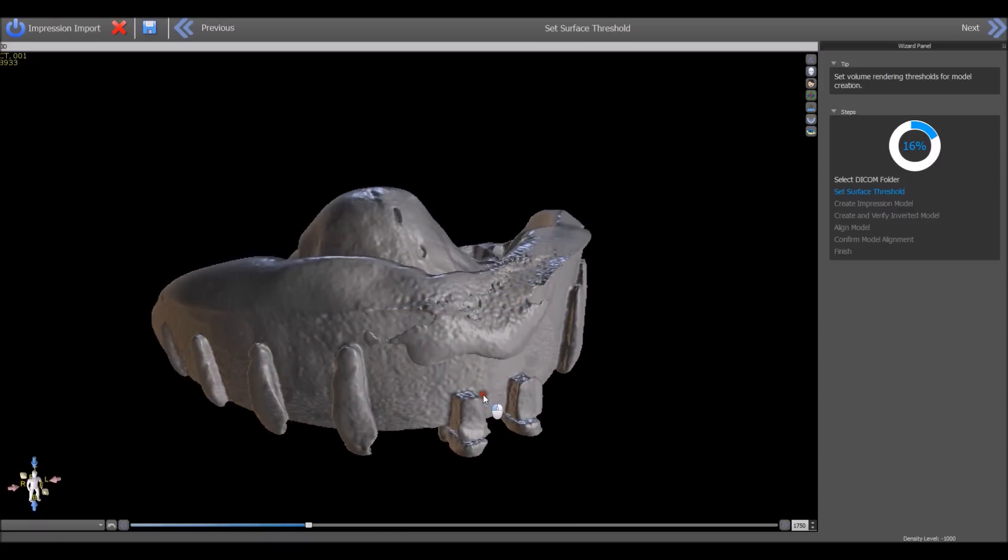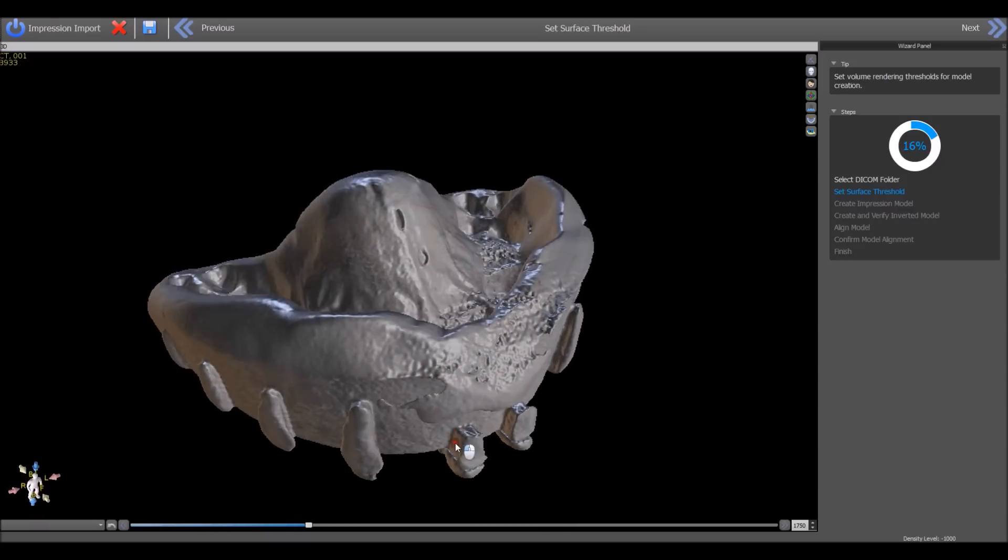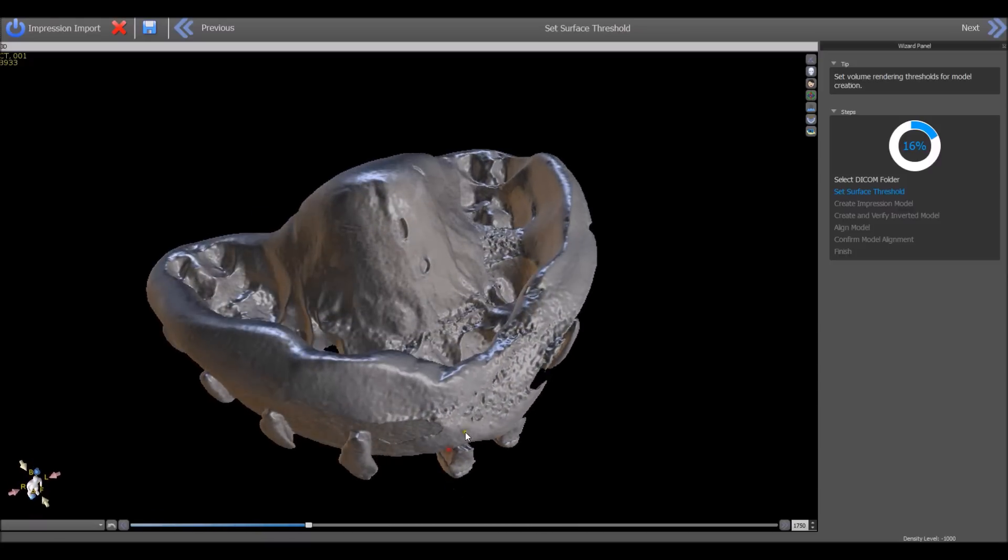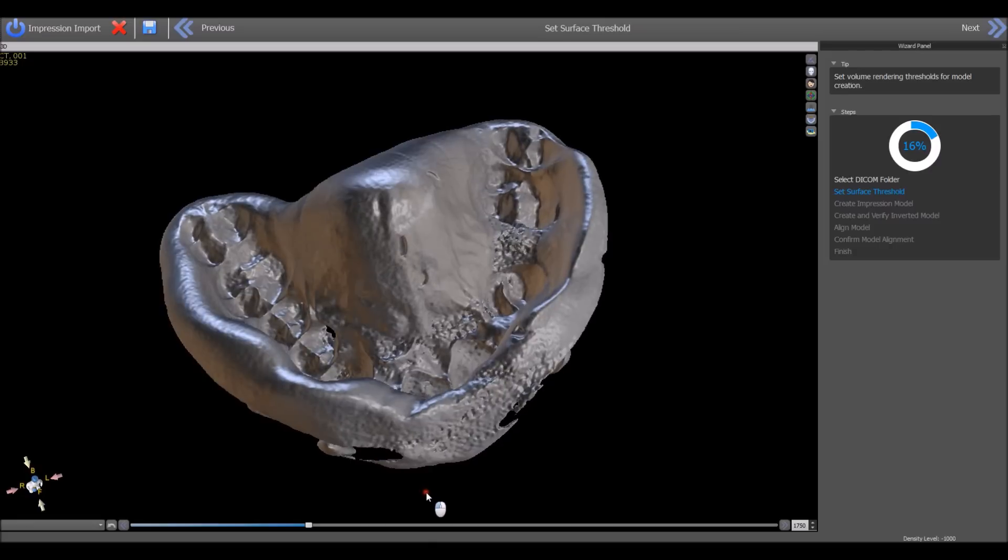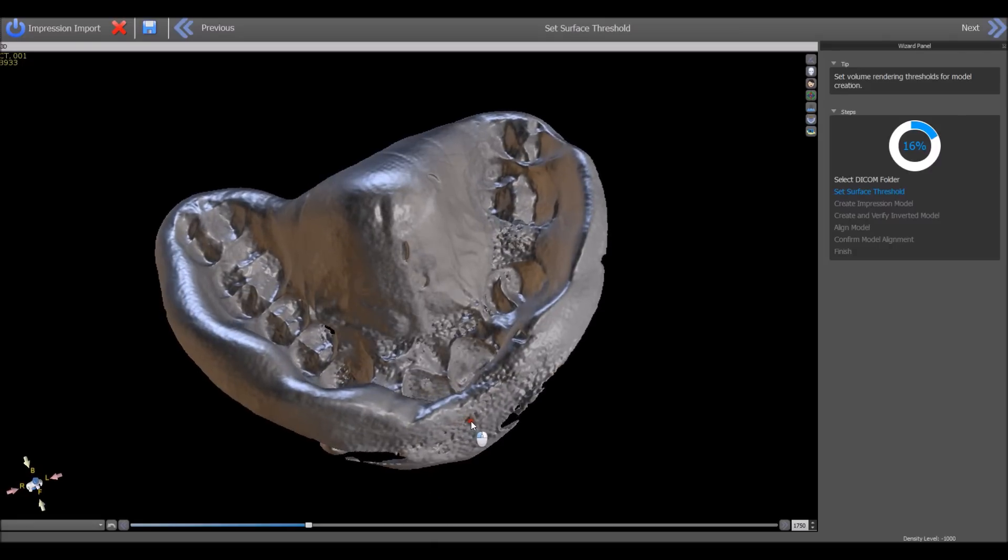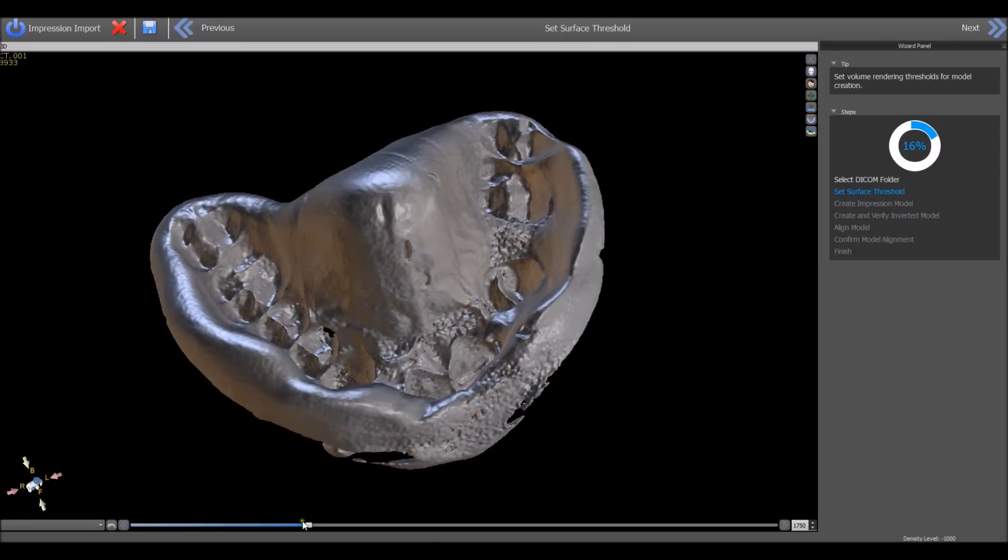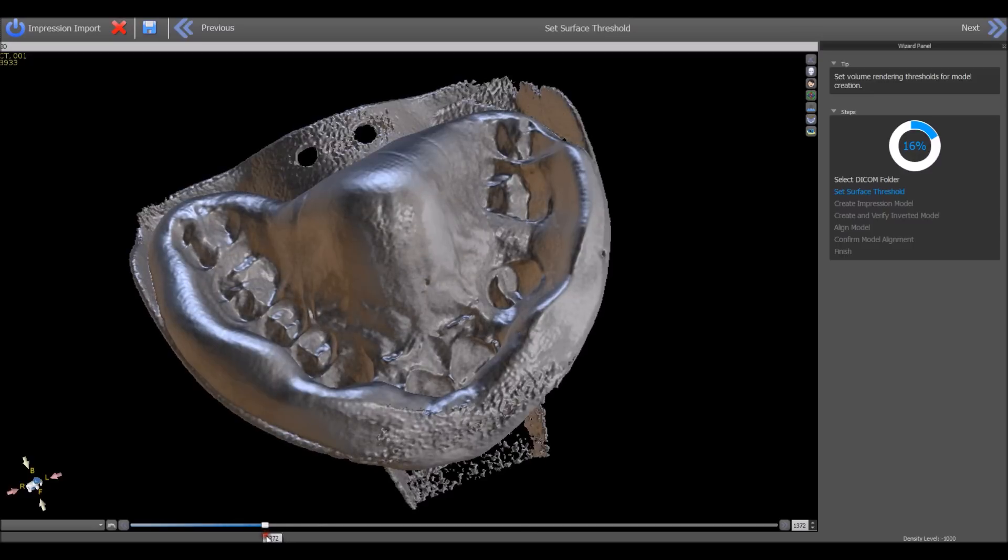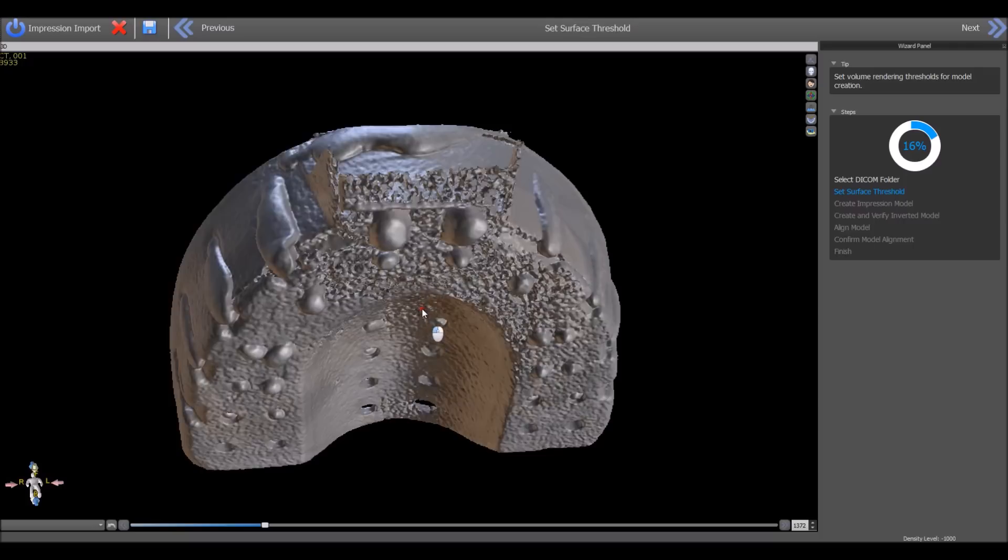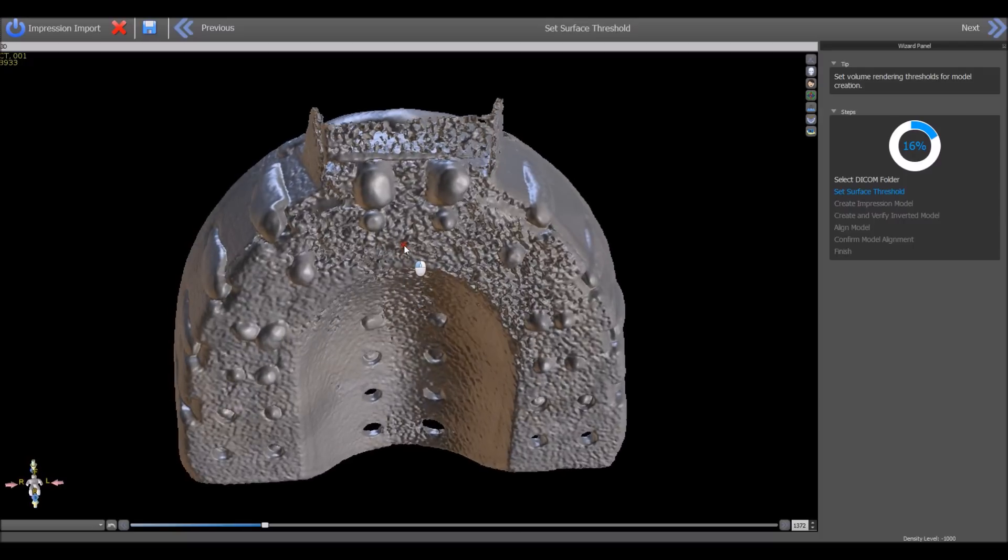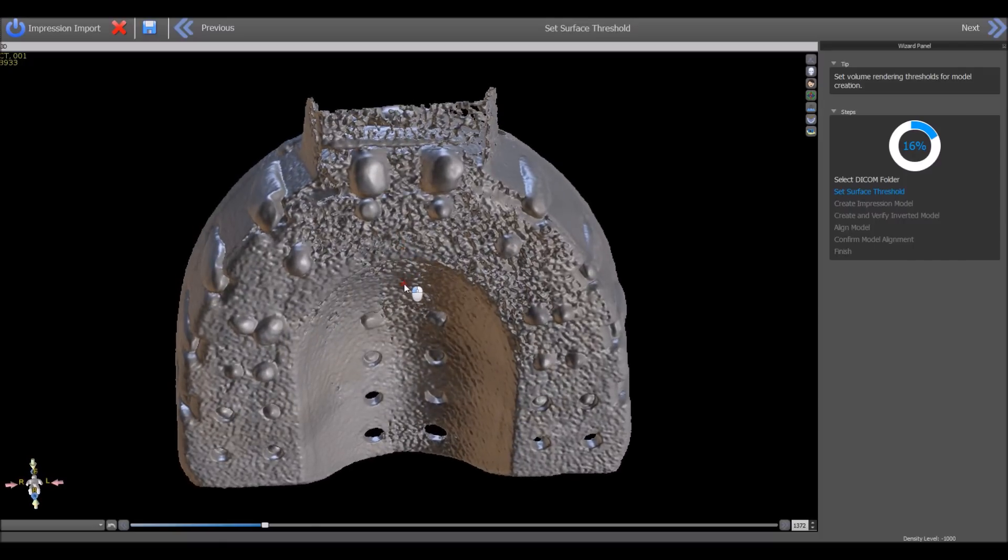At this point, we want to adjust the density threshold to make sure there are no holes in the impression, and this is important when you're creating the impression as well. You want to make sure there's material all around the teeth, that there are no holes in the impression from any direction in the relevant areas.